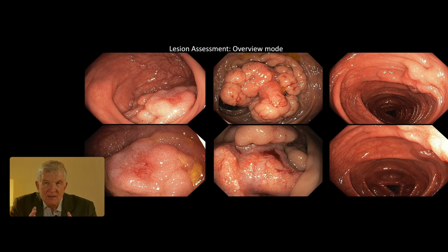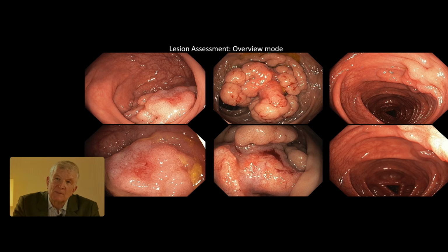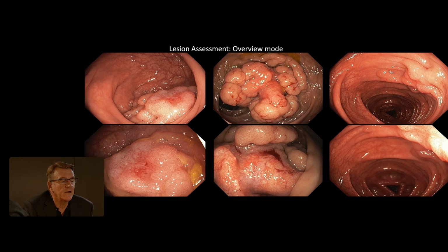One is a big polyp nodule. So it's the size, and it could be underneath and above. In these cases, we can see, the upper middle, this one? Yeah. So there are three cases in this direction. So that is the same as that. This is a nearer focus, and this is focused in on that irregular area. I should have made that clear.